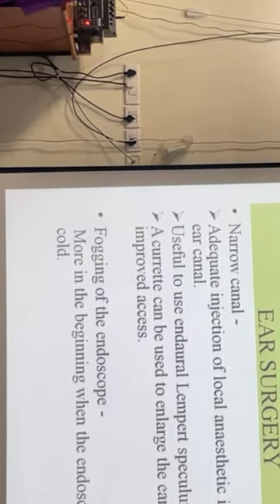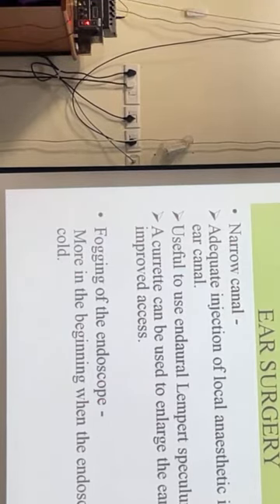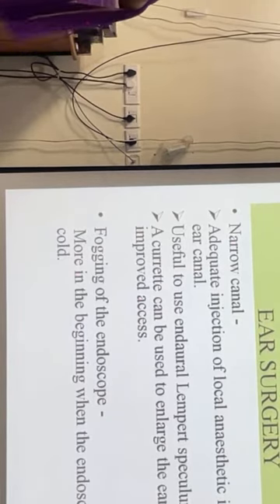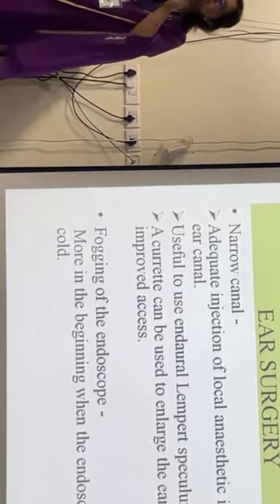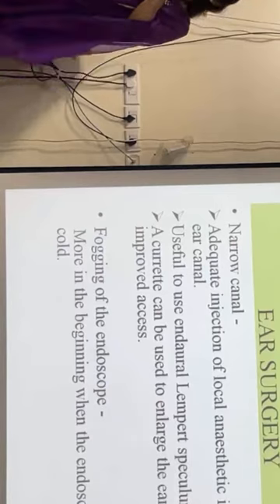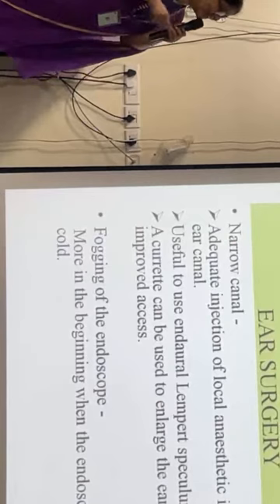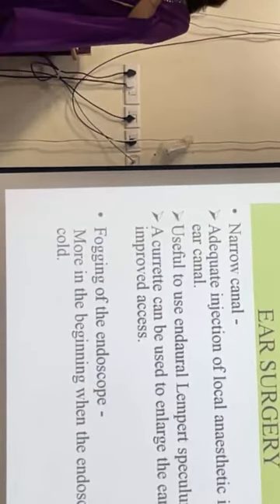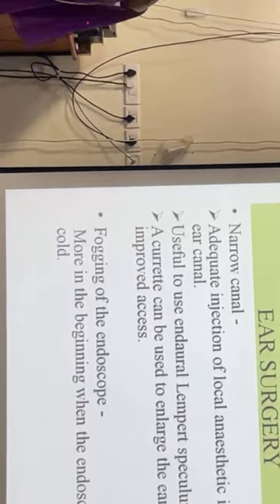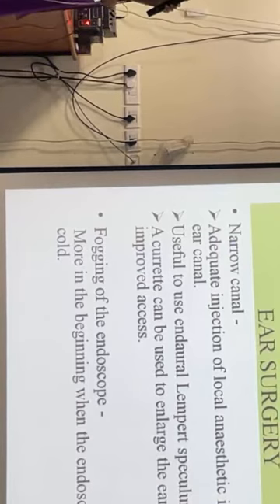A curette can be used to enlarge the ear canal to access. Fogging of the endoscope. Now this is very irritating, but I have seen that when someone is senior, there is no fogging. When someone is junior, there is a lot of fogging, irritation, and bleeding is more. So with experience, you gain that calmness and composure, and all this will help as we keep doing more cases and our comfort level increases.